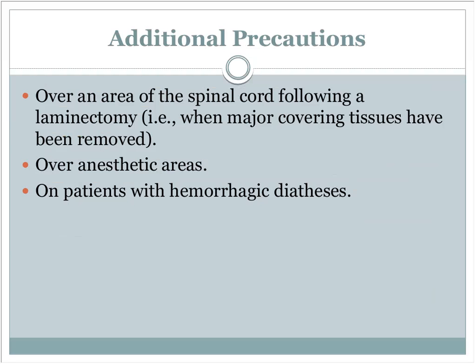But, you know, look at the skin, look at the area, look at the individual. Are they a good healer? Are they a bad healer? Do they take more time to heal? Does the area look well healed? Then you're going to be okay. Anesthetic areas, you need to just be aware of that. Know that this person may not be feeling what you're doing, and if you have it turned up too high, you can cause burning. So just be aware of that.